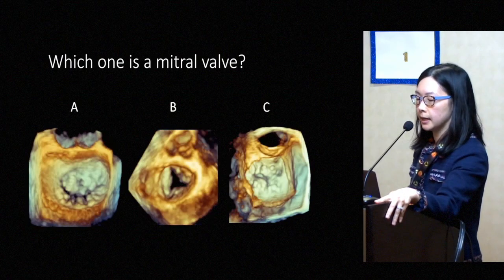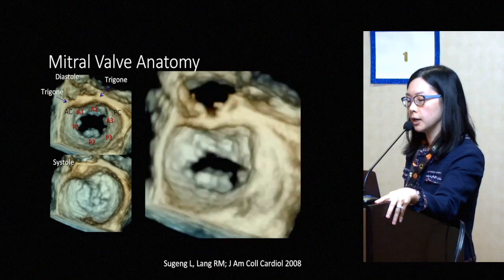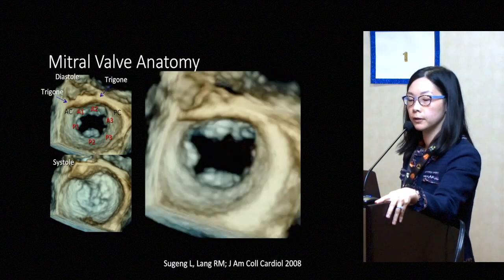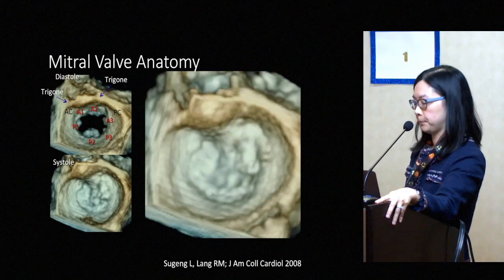This is a nice picture showing the mitral valve once again, and the labeling and how we can identify all the structures. Typically on 3D echocardiography, your echocardiographer is going to put your aortic valve at the 12 o'clock position for the 3D image, and your left atrial appendage is always going to sit on this side over here on the left. Then you have your anterior and posterior leaflets respectively at top and bottom, and then here's your tricuspid valve, and your pulmonic valve sits back here.